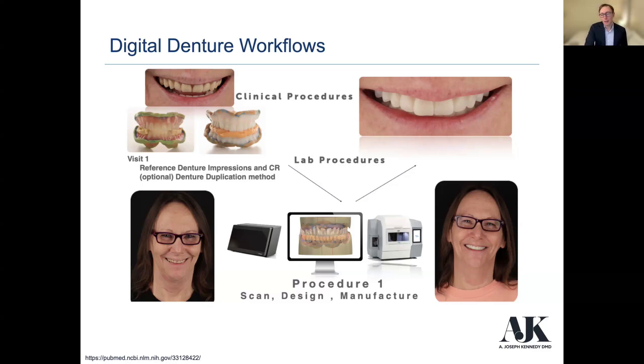Send that to the lab or you can scan it yourself. I recommend sending these to the lab as long as the patient's okay with not having their denture, which they may not be. If they aren't, then you might scan it in your office. But having this information sent to the lab in some capacity, whether you're sending the denture or scanning it yourself, and then they go ahead and just make any design modifications if they need to, and then they can print it or mail it, and then the patient's got it.